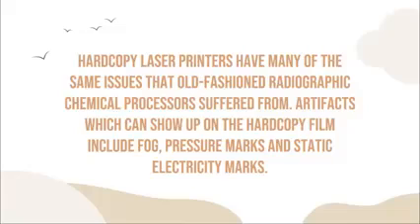Okay? So, for an example of the uneven scan line distribution, ayan. So, as you can see in the picture, di ba na siya yung mga line dala. This is just an example na ma-produce sa inyong printer. Okay, uneven scan line distribution.